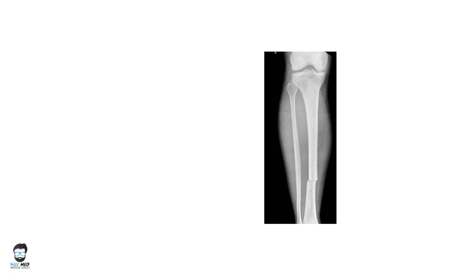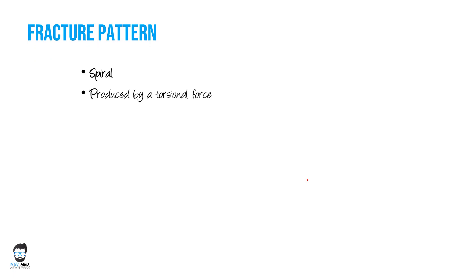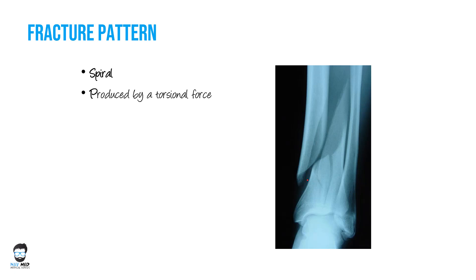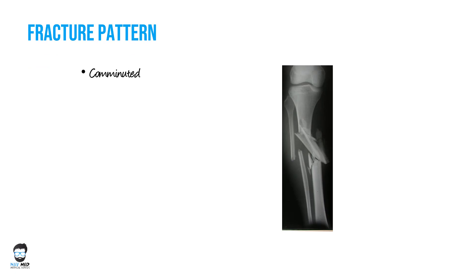Now let's look at fracture patterns. A transverse fracture goes straight through the bone and is usually produced by distracting or bending force. A spiral fracture is produced by torsional force and runs in a spiral pattern. A butterfly fracture has an extra separate fragment and is usually produced by pure bending force. A comminuted fracture is where the bone is broken into many pieces, typically a high-energy injury from combined forces, commonly seen in motor vehicle accidents.